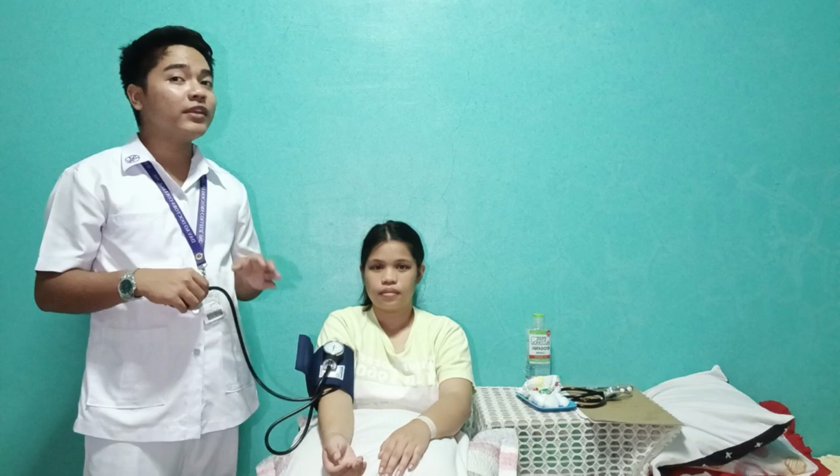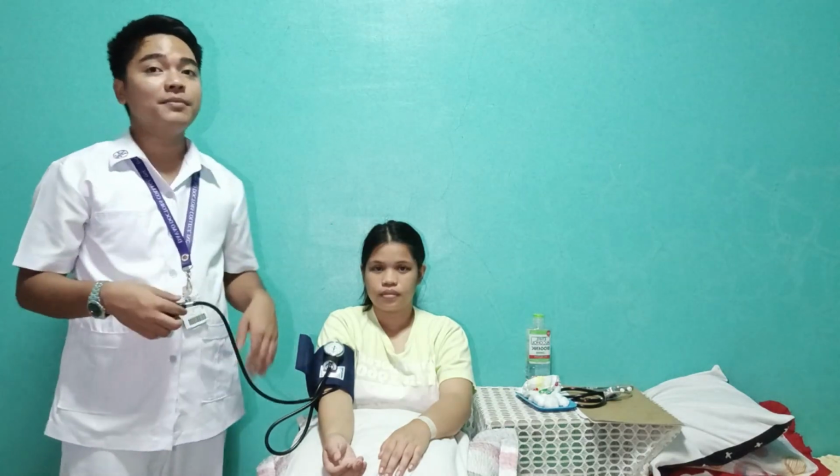Once I have found the brachial artery, I'm going to start inflating the cuff until I can no longer feel the pulse of her brachial artery. So now I'm going to deflate the cuff, and I have already taken her estimated systolic pressure, which is 140 millimeters of mercury.